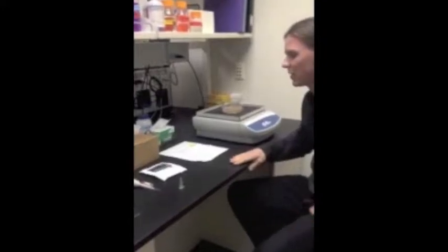I'll be introducing IHC, immunohistochemistry. The purpose is to tag things like proteins with antibodies, and we tag the antibodies with fluorescence in order for us to look at it on a confocal microscope. We start out by washing the tissue in a phosphate buffer solution on the shaker, and then we move on to a blocking solution, which is composed partly of normal goat serum. I just like the name of that. And then next we move on to the primary.